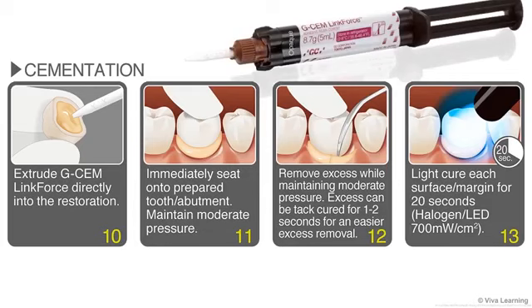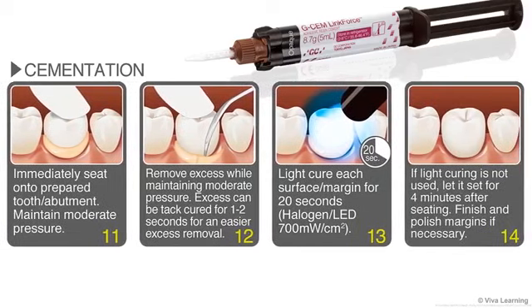Extrude G-CEM LinkForce directly into the restoration and then immediately seat it onto the prepared tooth or abutment, maintaining moderate pressure. While continuing to maintain moderate pressure, remove any excess cement. The excess can be tack cured for 1 to 2 seconds for easier removal. Then either light cure each surface or margin for 20 seconds, or if you're using self-cure mode, let the restoration set for 4 minutes. Finally, finish and polish the margins as necessary.